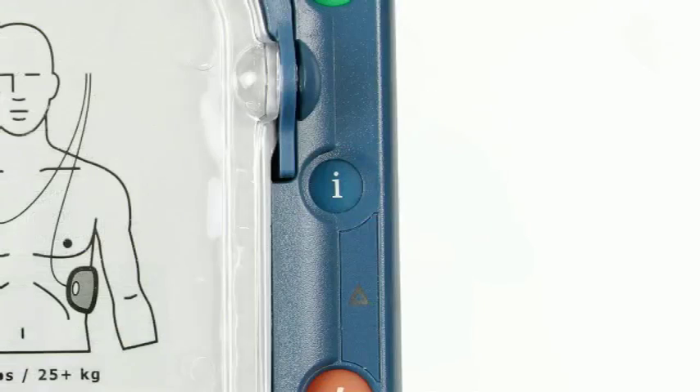The info button at the front of the unit is for use by the defib user when they need CPR guidance. The defib will again prompt you when to press this button.